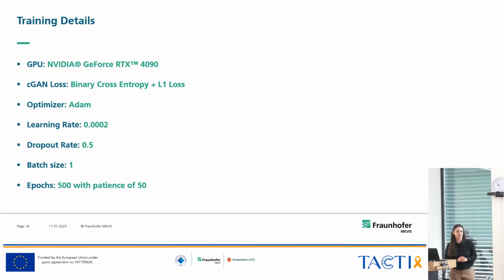And for loss, I used the BCE combined with a weighted L1 loss. Exactly, thank you. What is the loss function that you use? BCE and L1 combined. Because BCE sometimes gives you images that it thinks look pretty much like the ground truth, but to be sure that also resolution and contrast is the same, just as in the question we had, I also used the weighted L1 loss for it.